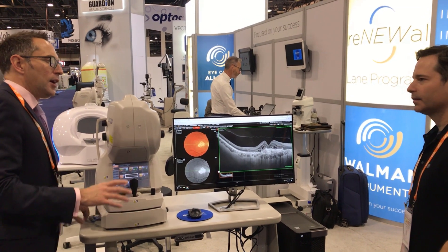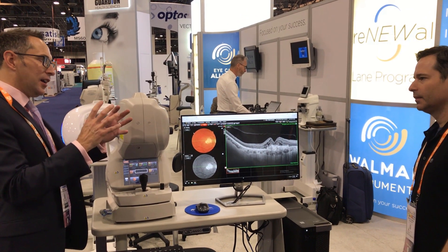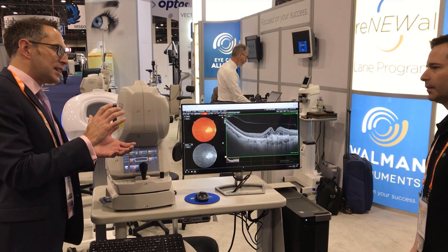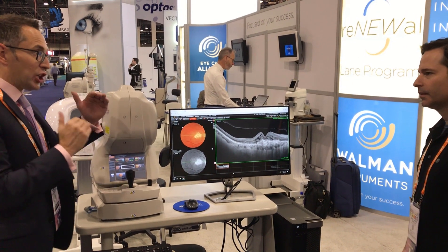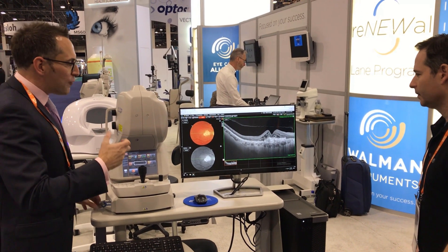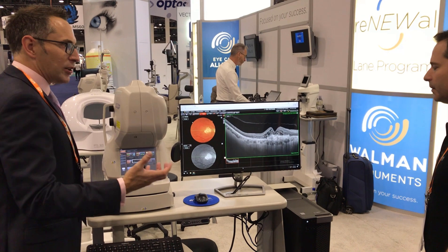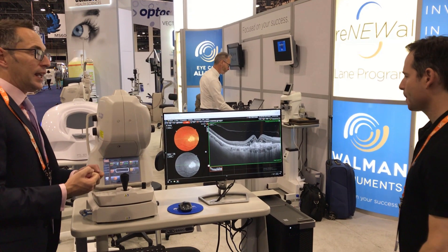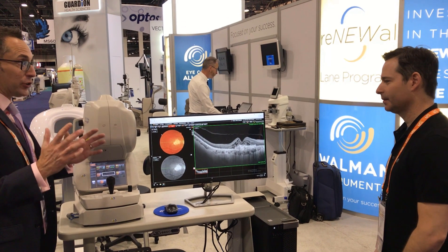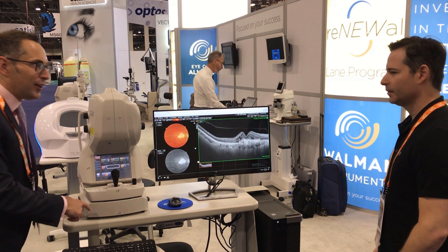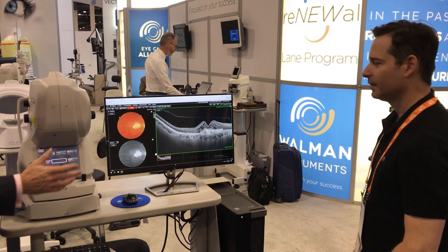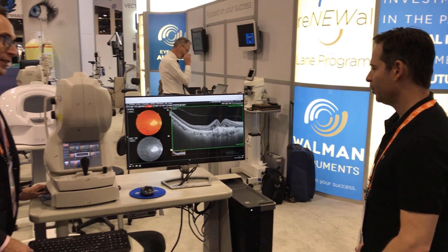Most importantly, masses of data in a data cube. We take 256 V-scans in a data cube like this. What you see is very, very dense information that we can extract what we need, just the same as we described earlier about that wide field scan. This machine can capture the total globe, and the reason it can do that is that 1050 nanometer wavelength.